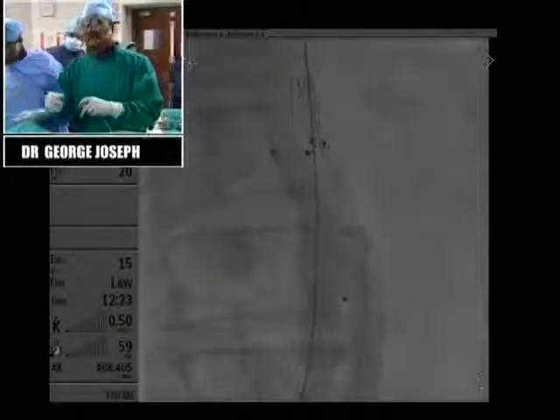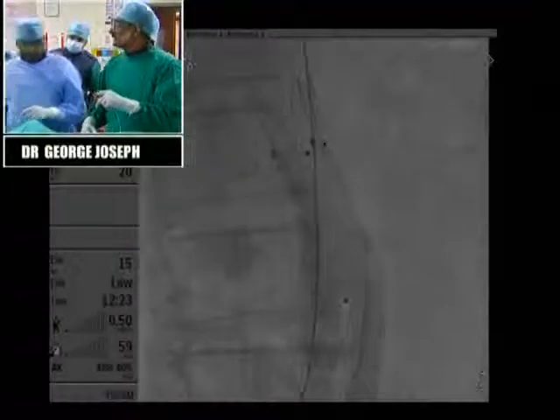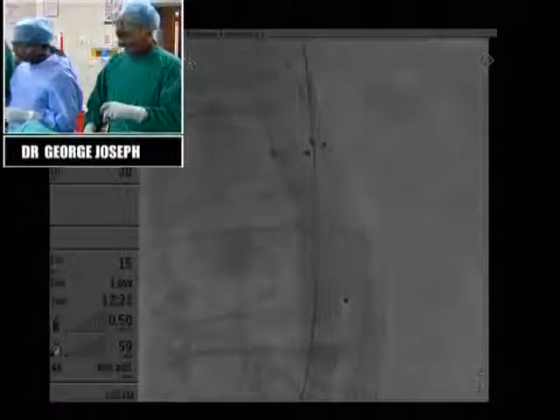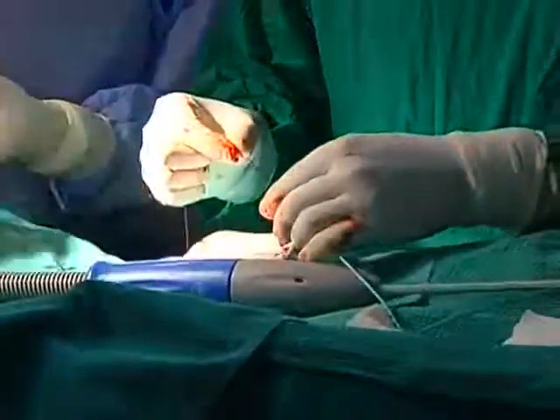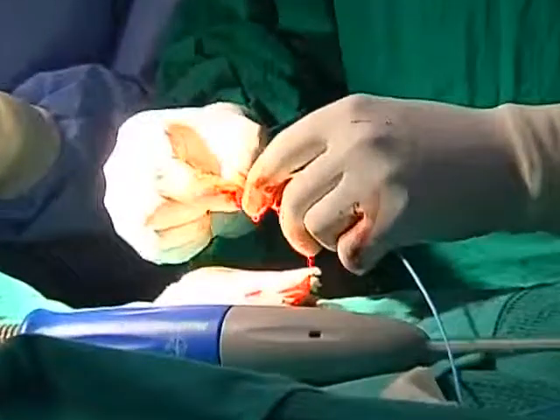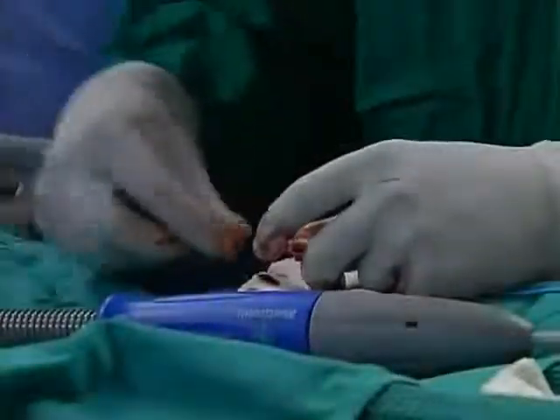Okay, get back the glide. Angled Terumo, please. After that, I want one more stiff wire. You can also use the Reliant balloon to put it across the wire once you've crossed to confirm, and dumbbell it into the open arm of the contralateral limb so that everybody is 100% sure that you're actually inside. But what I do is that I actually rotate the catheter, try to touch the other wire, and if it touches and you can see it moving, then you know that you're inside. But it's important to make sure that you're in.